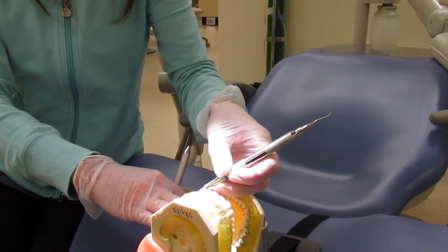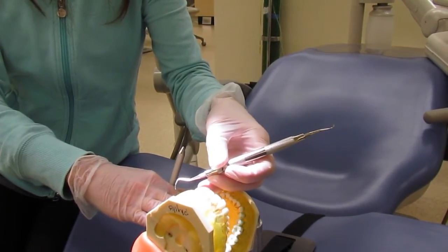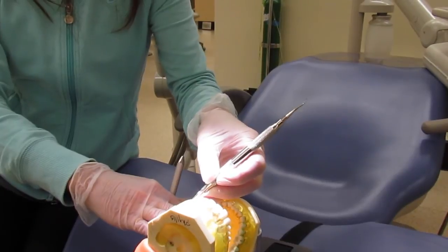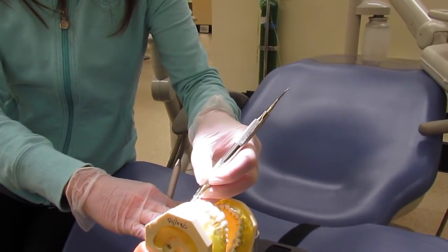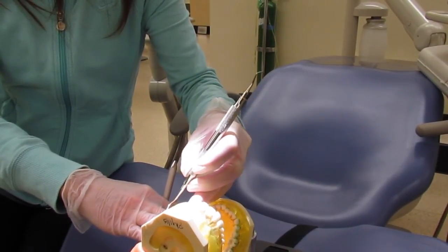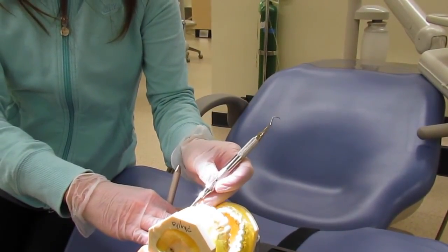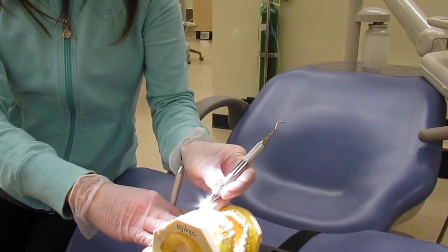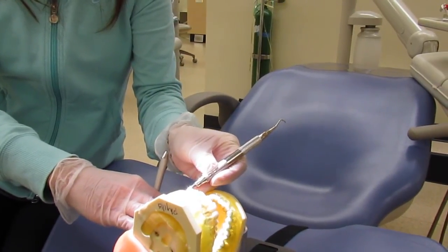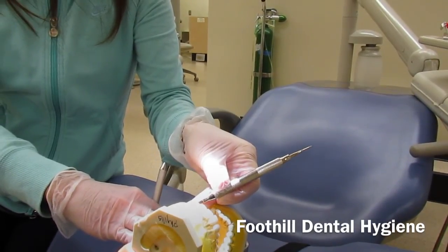This is the UC on the buccal of number 15 again. We will be fulcruming on the lingual cusp, starting at the distal line angle, then rock and go distally. Coming back out and going mesially, you can use an extraoral fulcrum resting on the side of the face, then start at the distal line angle with short pulling strokes. Coming around the mesial line angle, go ahead and roll the instrument and pivot as well.